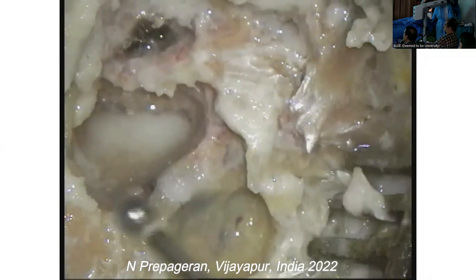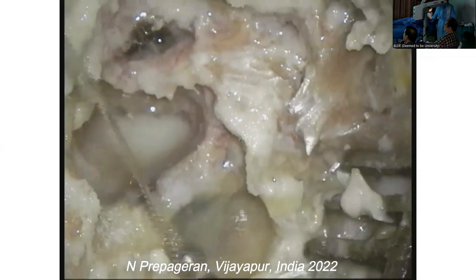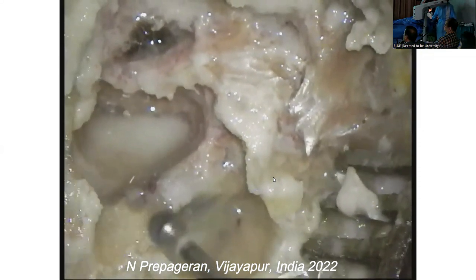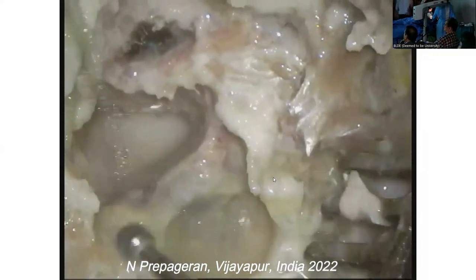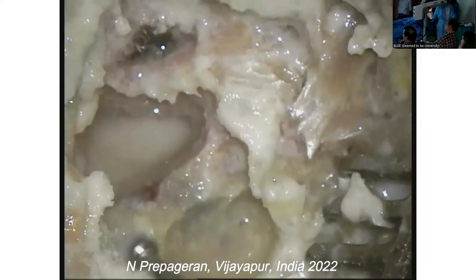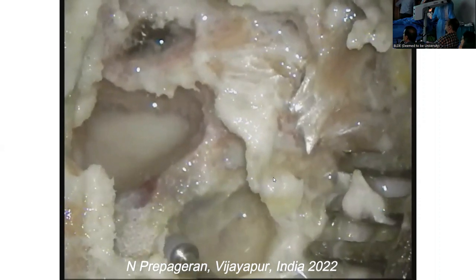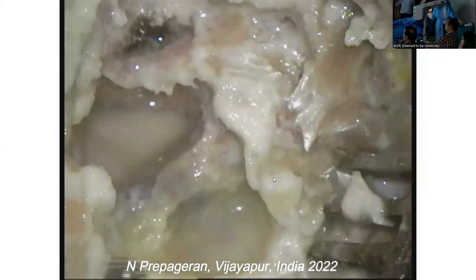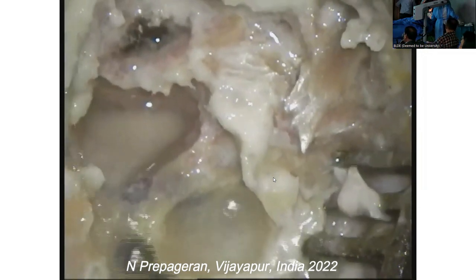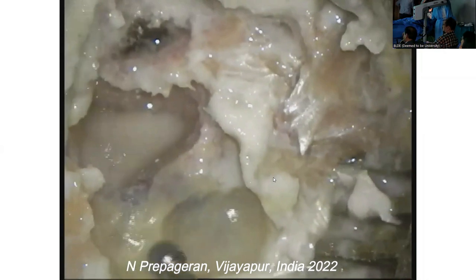Now, what I want to do is to find and follow the transverse sinus. So you see the drill is wobbly. Can you guys see that? So this is dangerous in real life because you can't control the drill, yeah? But for dissection it is okay. That's transverse sinus, guys.